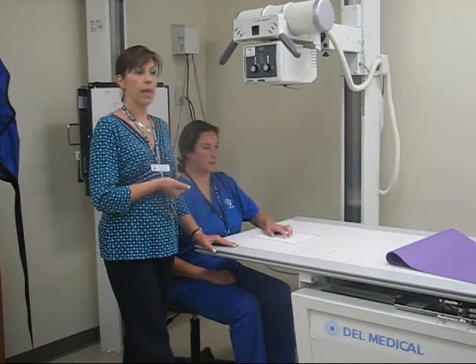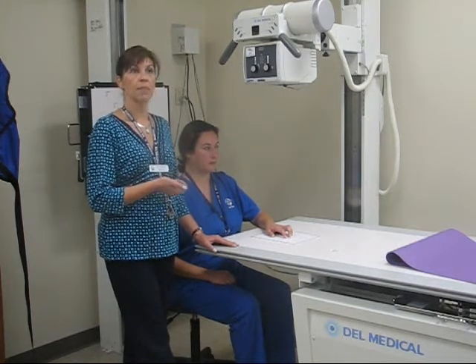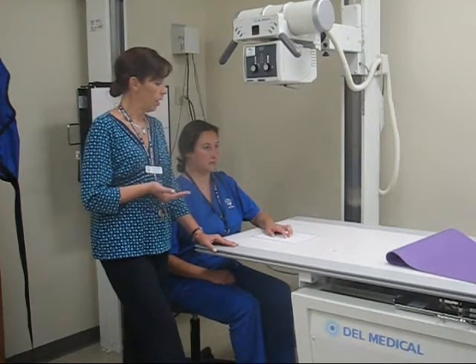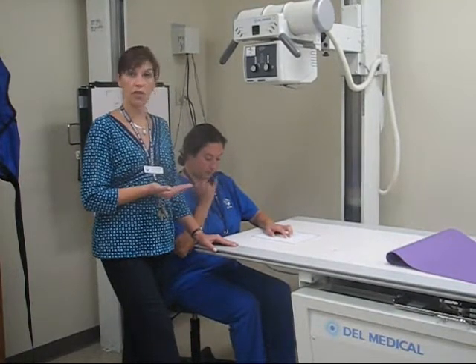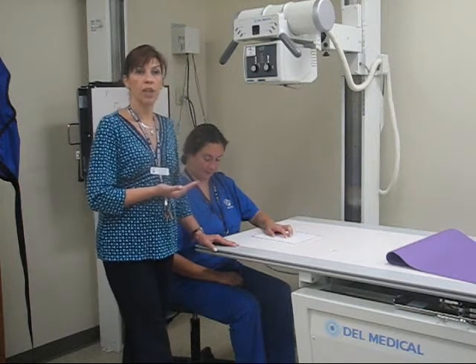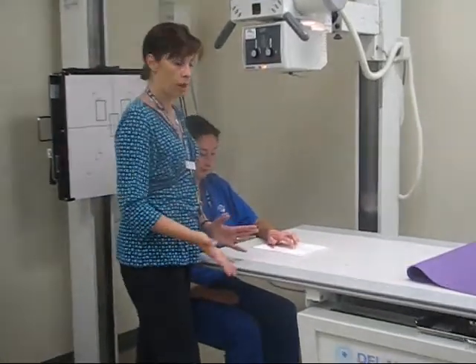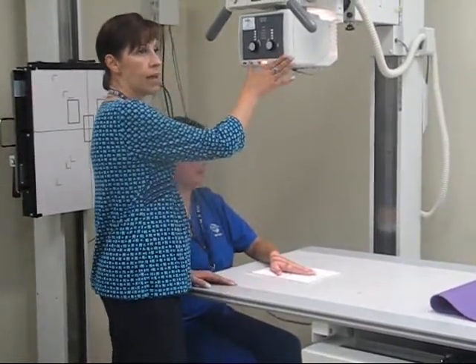In a lot of other places, you would have to present a PA projection of the hand and then a lateral and oblique of the finger of interest. So I'm going to demonstrate a general projection of the fingers as a whole, and then I will demonstrate a projection of the thumb as the finger of interest.